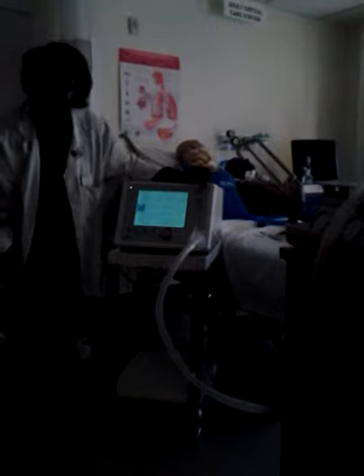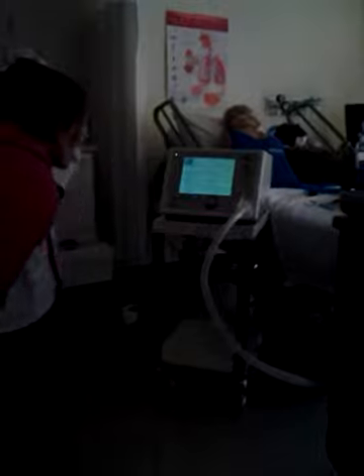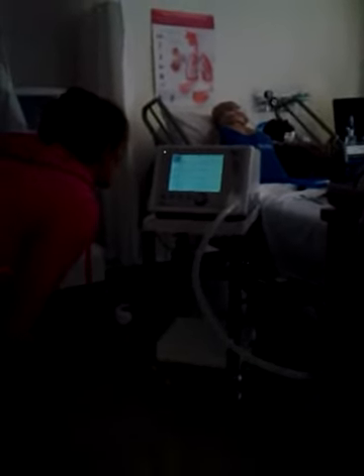We're just talking it out. Like a Jersey Shore doctor came in, he was like, put them on BiPAP, and he gave other parameters, it was 10 over 4. So you would say to the doctor then, Mary, I know you want them on a 10, but their tidal volume is at this. Do you think we should bring them up, down, whatever? Exactly right.